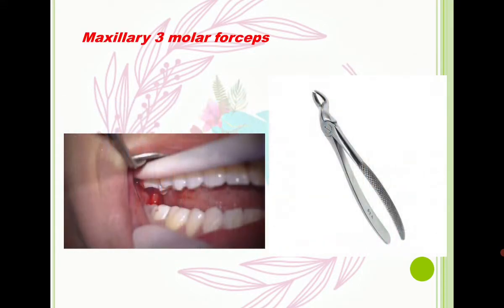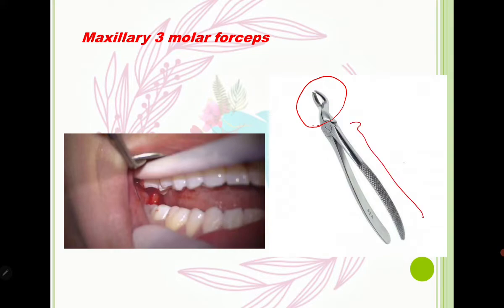Now let's check the maxillary third molar forceps. The working part is the same as first and second molar forceps, but pay attention to the handle — the length is different and it's longer. This is because the third molar is located far from the midline, so the increased length helps us reach and better access the third molar.